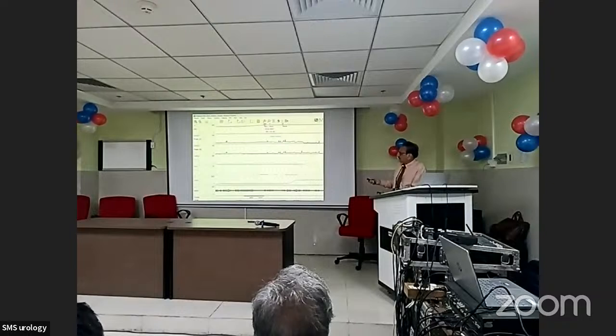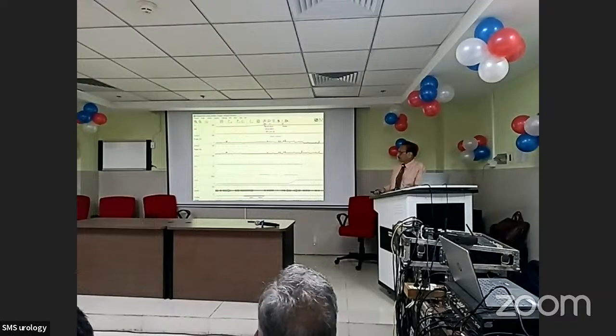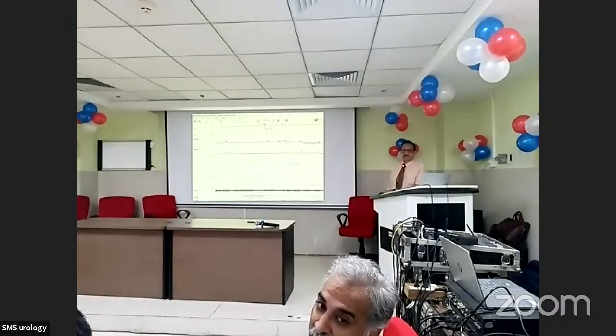She happens to have poor sensation. That doesn't matter. She has a very large capacity. But what has happened during voiding? There is no demonstrable rise in pressure, but voiding has a problem. What would you call it? Can you label this? Anybody?